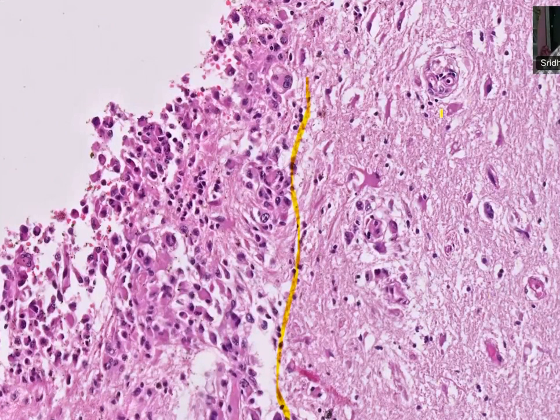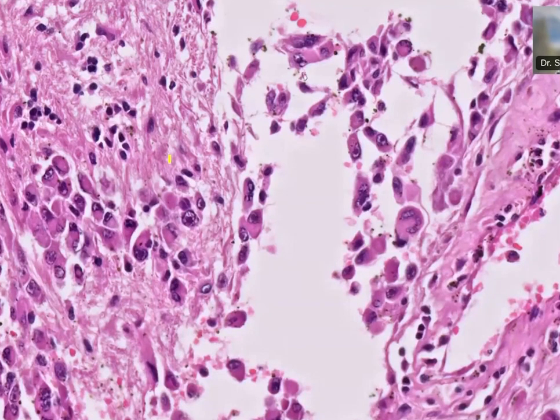We took the picture only to show how the tumor suddenly stops here. There are a few scattered cells minimally coming here. Unlike the first 3 cases you saw, where you could not make out the difference from normal parenchyma, here you can. The same tumor morphology is seen everywhere.